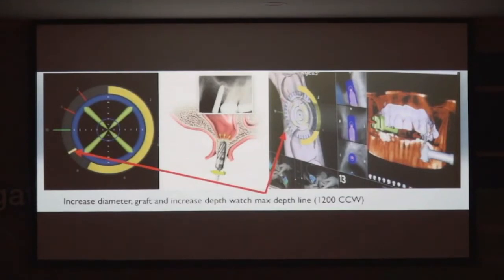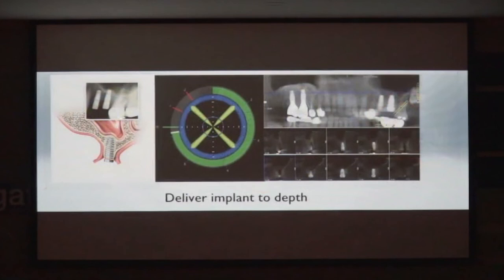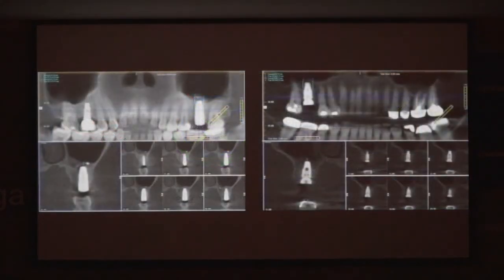That's in my hands. Now, this is a lateral augmentation that I did years ago, and this is a Densa-Burr sinus elevation right here, 2 implants next to each other. I'm going to show you some more. This is another one with a different kind of implant, and I'm measuring how much augmentation I got.